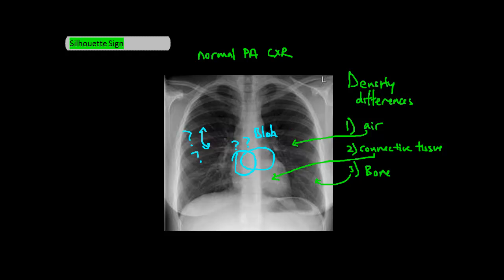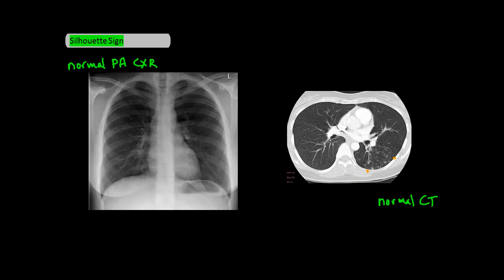To illustrate this point further, let's take a look at some films and CT scans. Look at the descending aorta on this frontal chest X-ray. Notice that you see one border of it clearly, while you cannot see the other border at all, represented by the dashed lines.